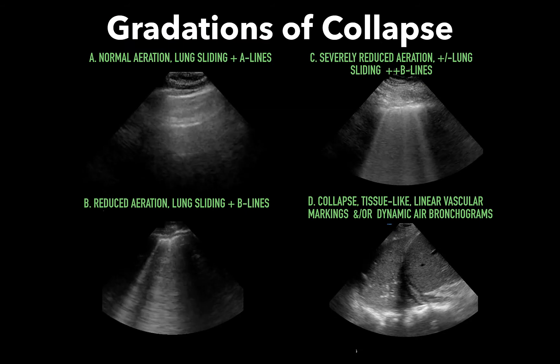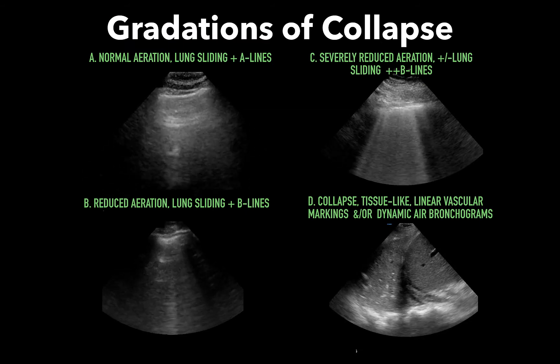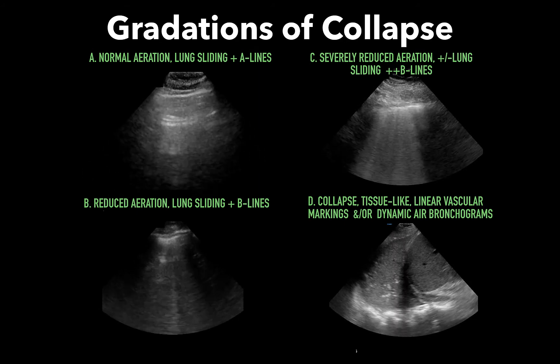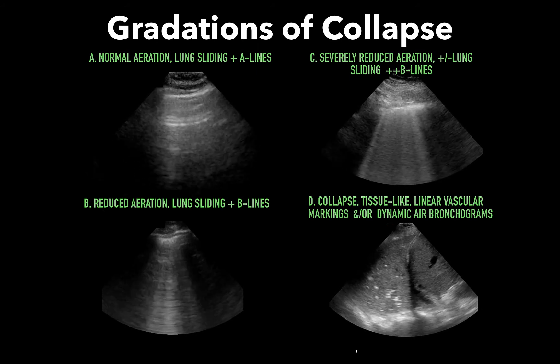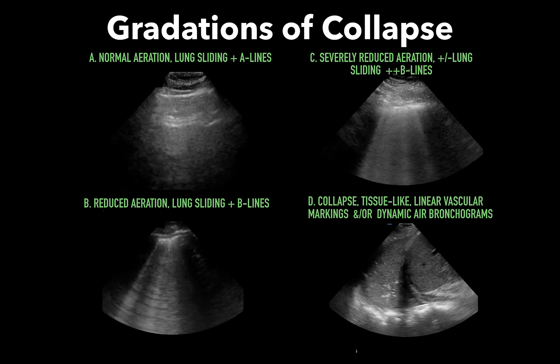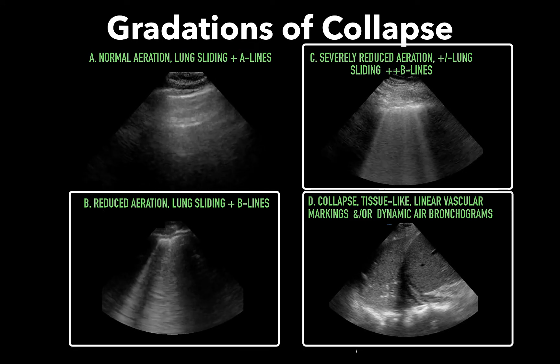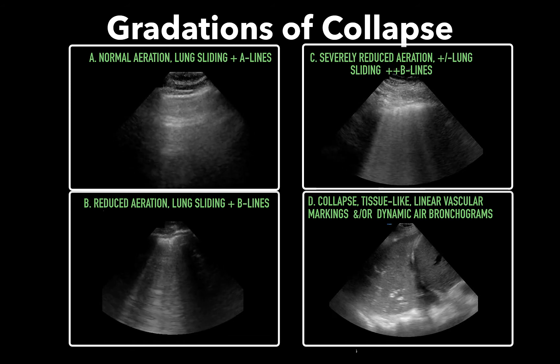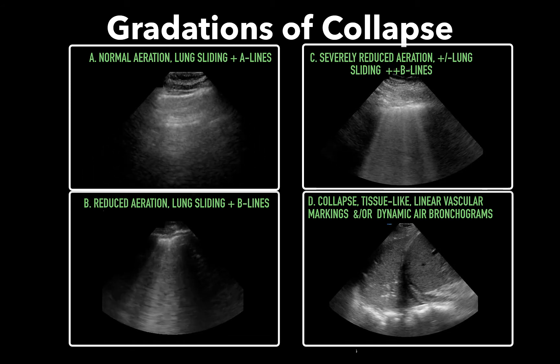Above the effusion, you'll often see gradations of collapse. Large effusions may lead to severe collapse, whereas smaller effusions lead to less. As you go from the effusion up towards the apex, you will usually see the progression from collapse to less collapse, to frequent B lines, to less B lines, to eventual A lines — representing the transition from collapsed lung to less collapsed lung.